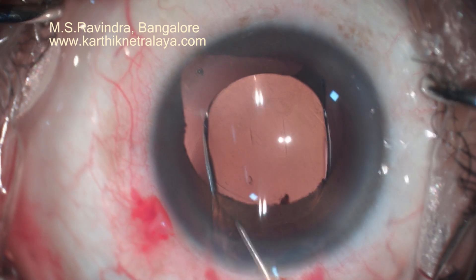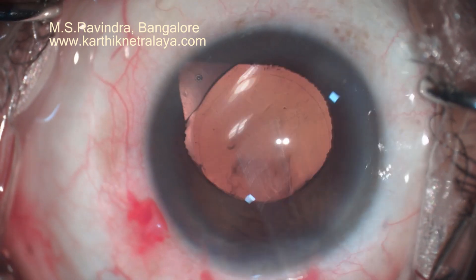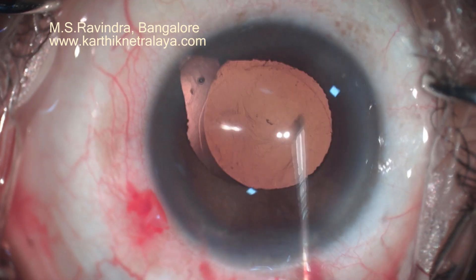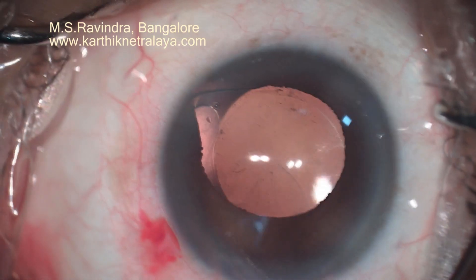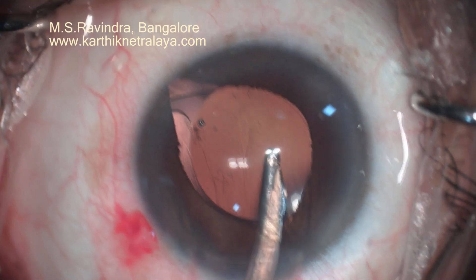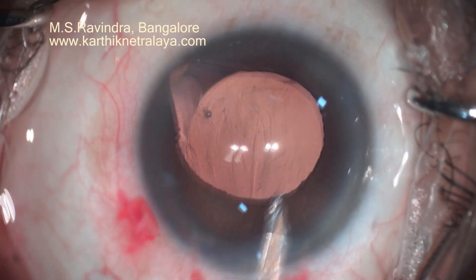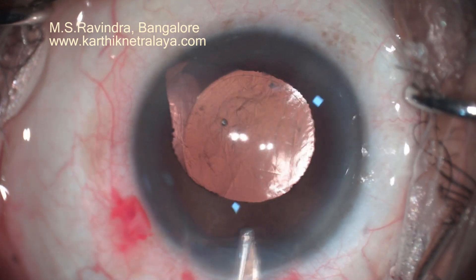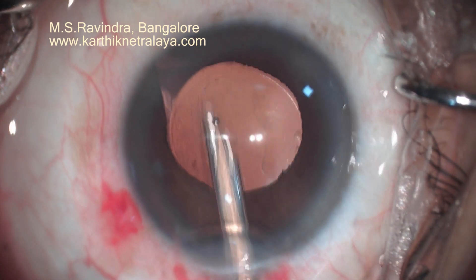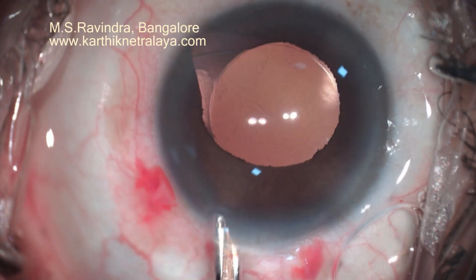That can be avoided by very gentle manipulations. The lens is introduced into the capsular bag. I take the advantage of positioning the wider haptic-optic junction in the coloboma area so that it can minimize glare. The wider base of the haptic is actually positioned at the coloboma area. Postoperatively, patients are much more comfortable because that area is now occluded and light is deflected elsewhere onto the retina instead of the macula.